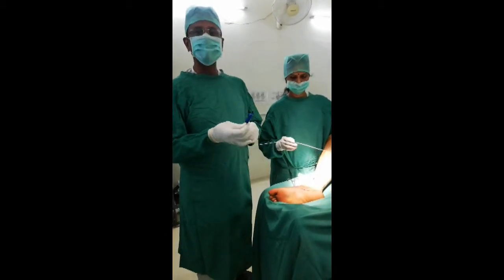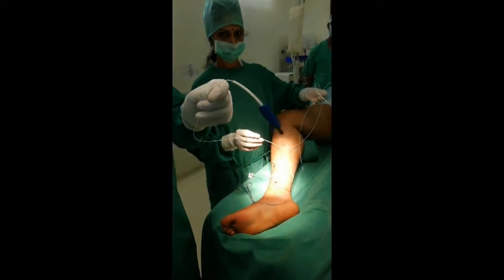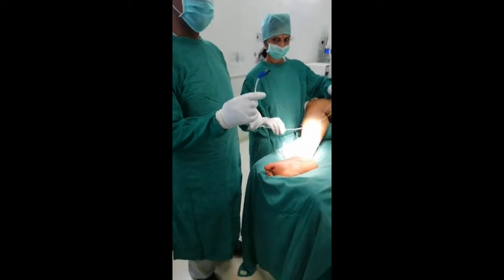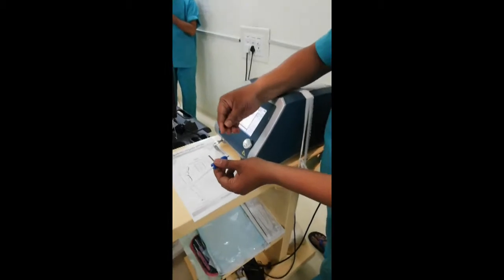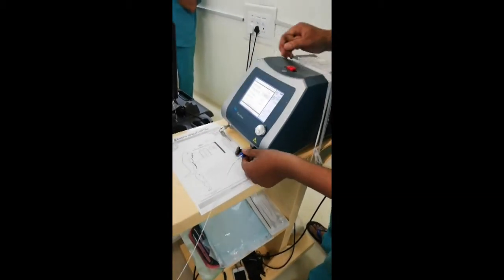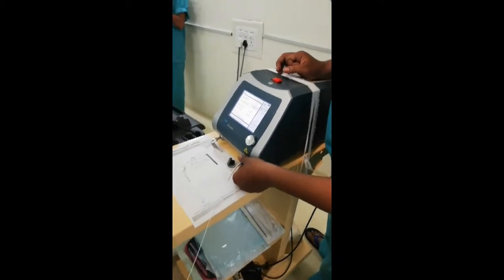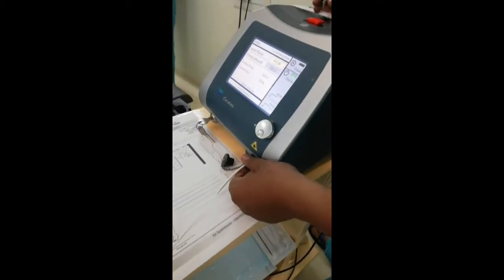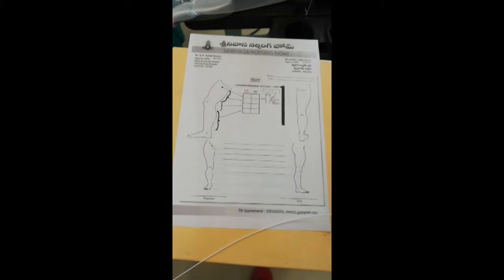Now this end is given to the assistant, who takes the protective cap off the tip and fixes it in the slot. Incidentally, the paper in front of the machine shows the recording of where we have got access to the sheath and also what the energy levels are that we need to pass.